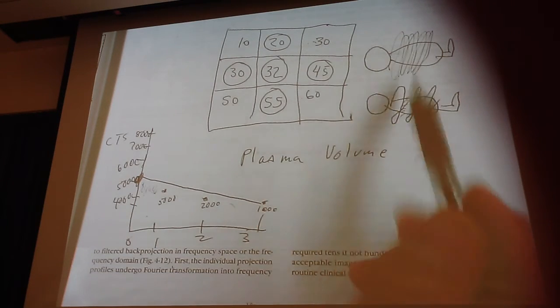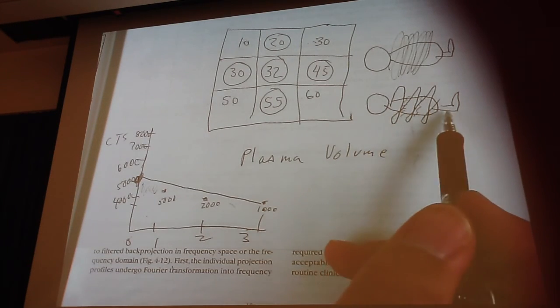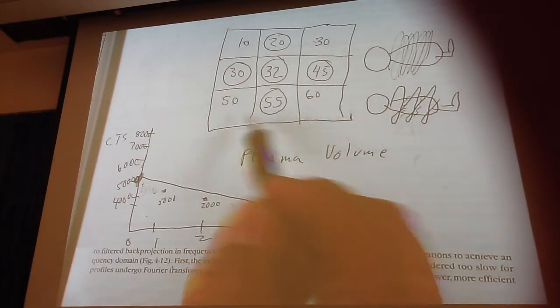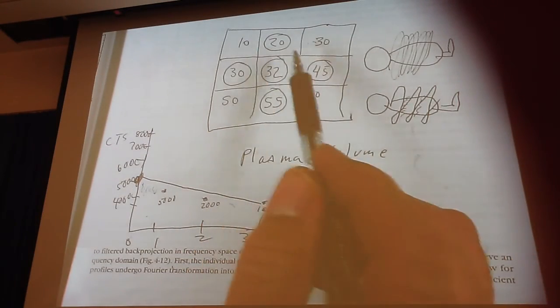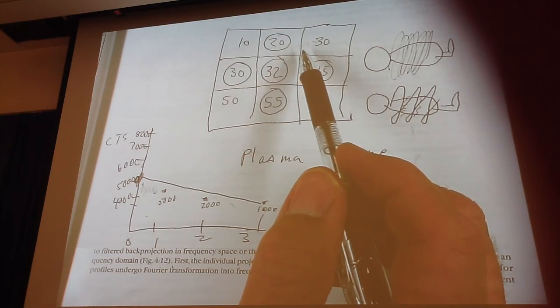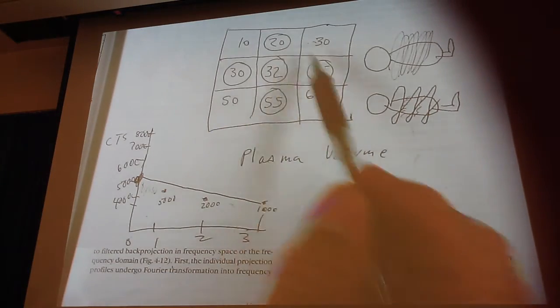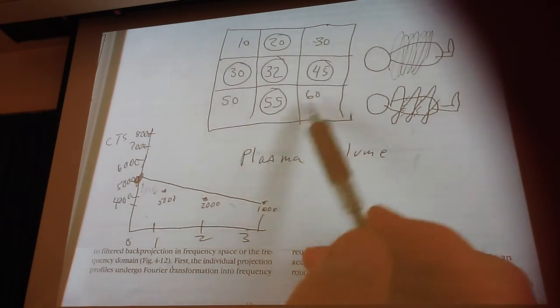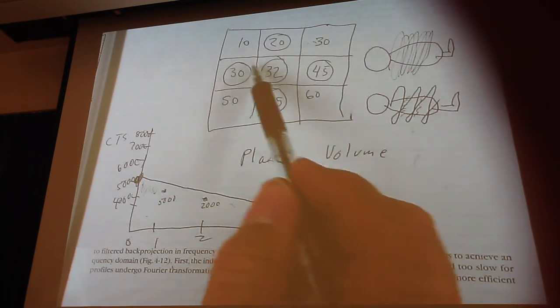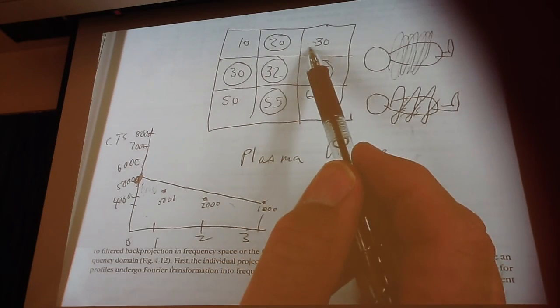We use it to artificially create data between slices and scans. And we also use it to make our image. Remember, you acquired this stuff at 64 by 64, and it's going to look like garbage. So we interpolate it to 128 by 128 simply by artificially expanding the matrix and calculating the average in between the pixels. Okay.